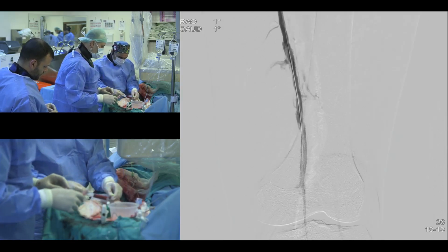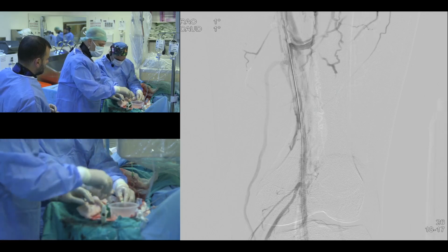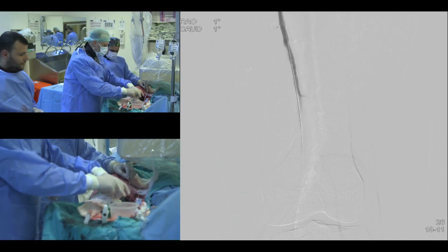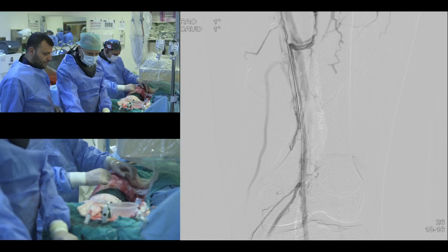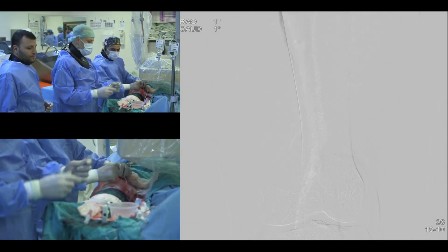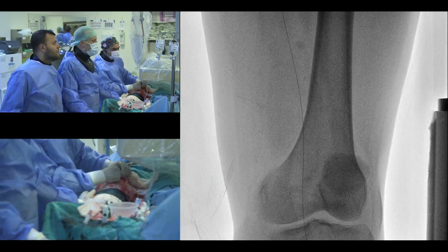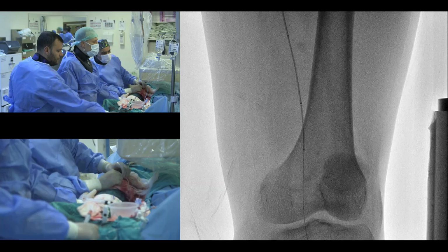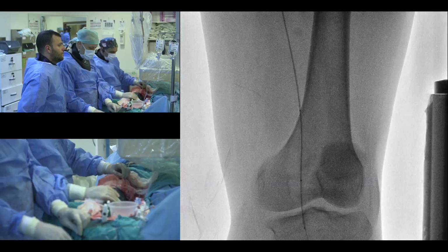Over here, I've put the antegrade because if you have disease all the way distally around the ankle and you come contralateral in a tall person, your equipment may not reach there. So sometimes for below the knee disease, it is better to stick antegrade. Secondly, the force that you can impart from the groin antegrade is more than if you are contralateral and trying to push things. That's why I put antegrade.